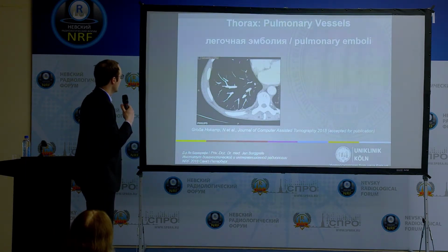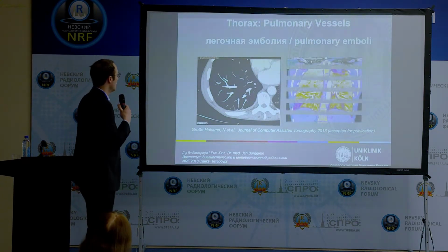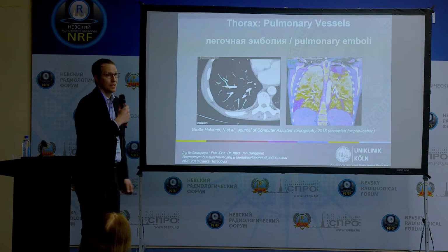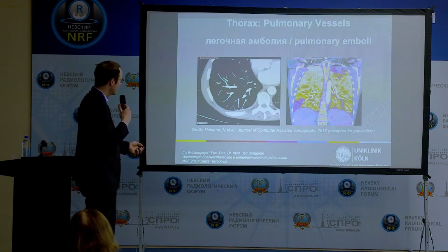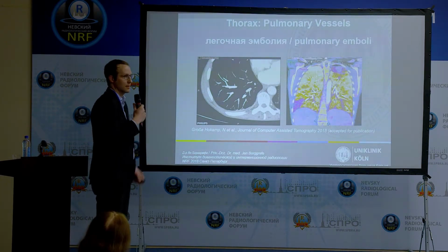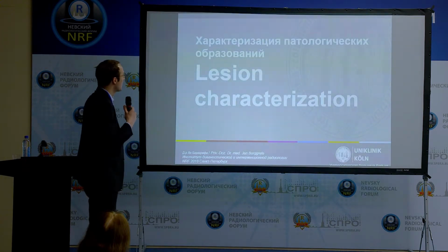This patient shows a depiction of pulmonary emboli, which you can now also detect with the iodine mapping. This is really striking because it leads you to the thrombus that is here and very hard to see, but you are really pushed to see that there is some lung emboli there, and you will find it when you're looking at it.